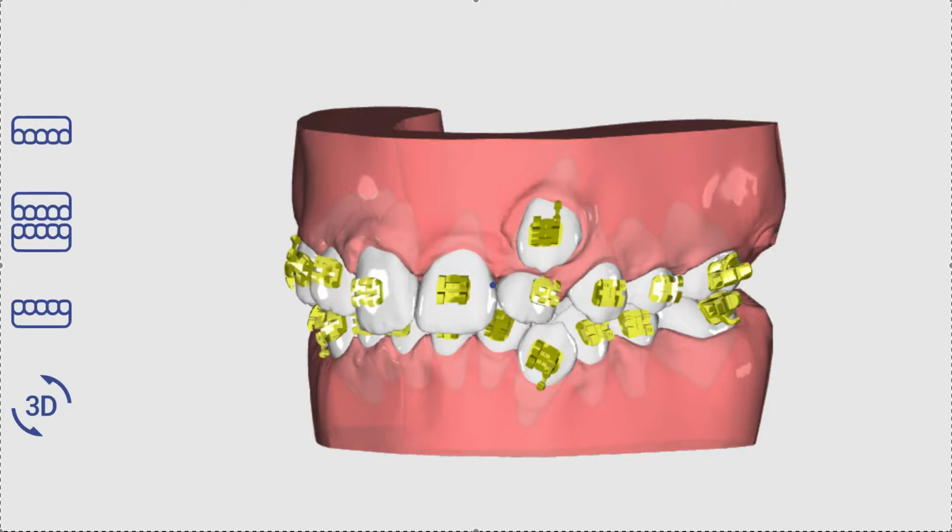So the way it works with Global is it works similar to how it works with white label aligners. I basically call them a white label design company for IDB. You're going to send them your photos, and I actually have a demo video. I'm going to create a playlist all about IDB and I'll mash it together. But if you can't find it, let me know.